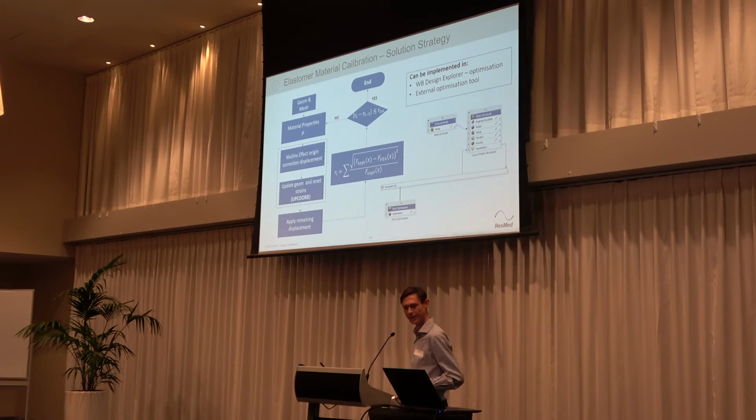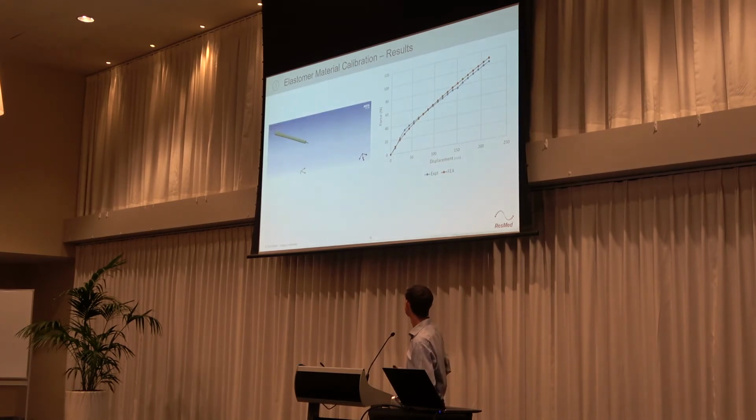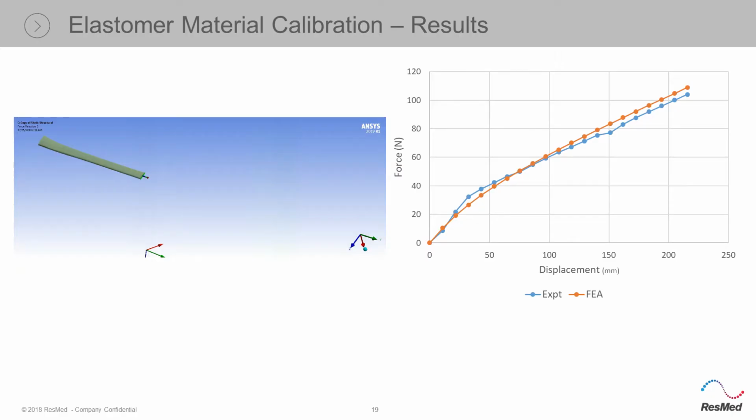And you can also make Design Explorer do it as well and keep it all within the ANSYS Workbench environment. So, on to the results. It's not that impressive just pulling the thing straight, but you can see how much that we stretched it.